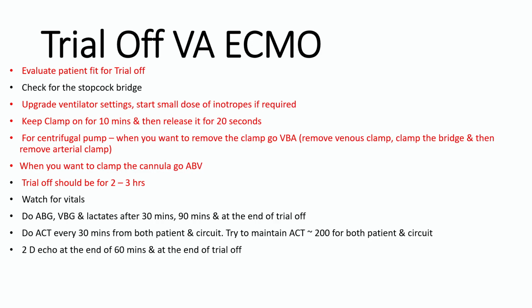Also look at the VTI and TDSA. The more reliable factors out of all the weaning trials, they said, are VTI and TDSA. In those patients where, as you come down on the flow, the VTI and TDSA show a rising trend, they usually have successful weaning efforts. And those who do not improve, or whose VTI decreases, have a high chance of weaning failure.